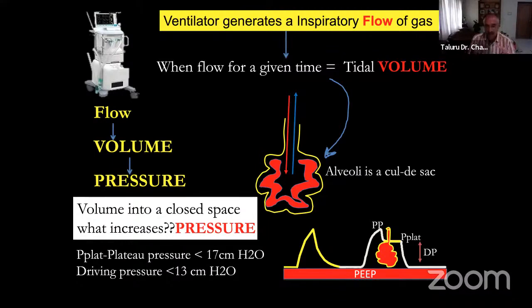Auscultation, everything looks all right. Then probably it is a chest wall issue. Then you can accept it, go up on PEEP, but don't go up on tidal volume. Just do a recruitment maneuver. We can also accept slightly higher driving pressures. Normally, when you increase the plateau pressure and the PEEP, the driving pressures will be around 13, 14, and 15 could be acceptable if the restriction from the chest wall and the diaphragm is very high.